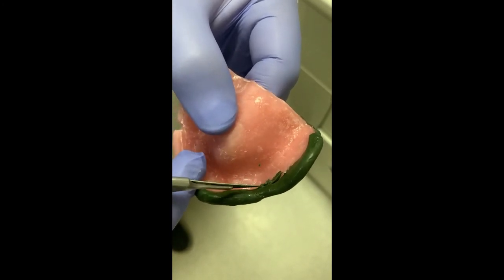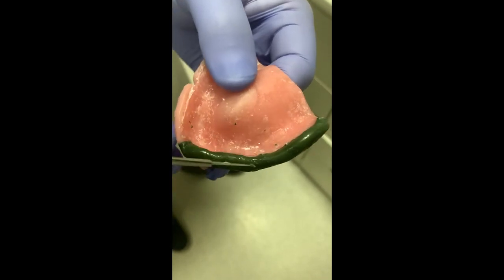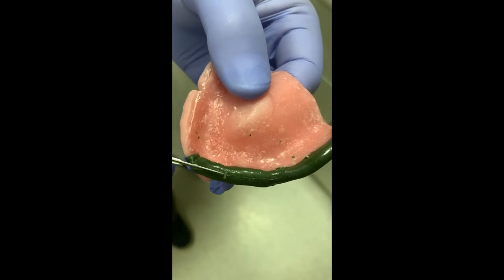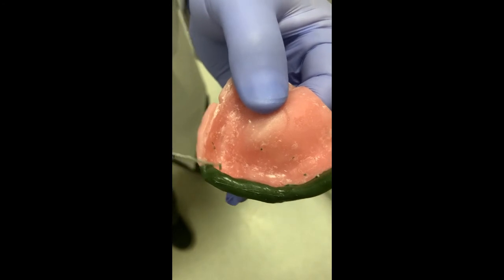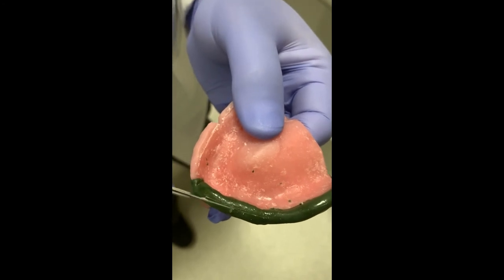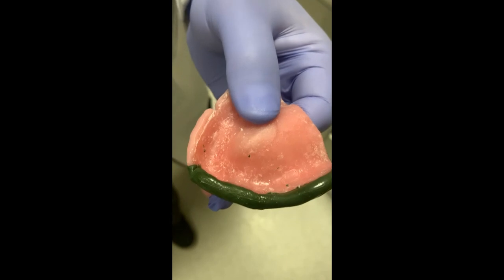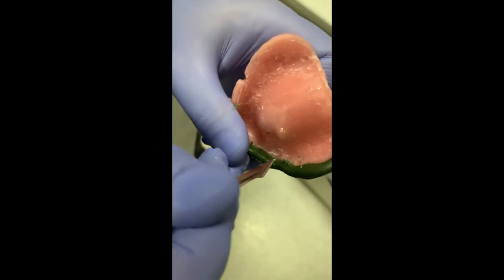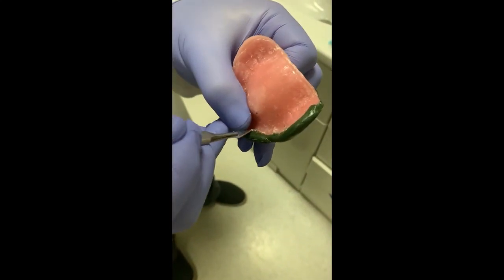Some authorities advocate the removal of the inside of the full width of the material — you divide it in half, and the inner half on top of the flange towards the fitting surface should all be removed. That is to limit the appearance of pressure areas on the final impression.